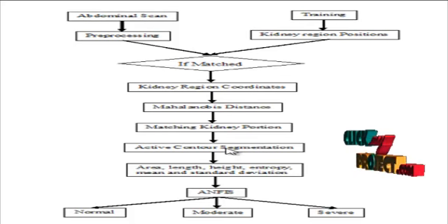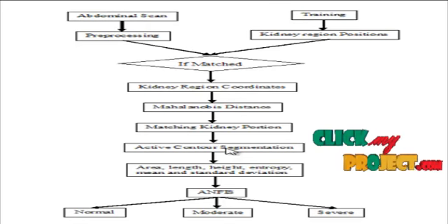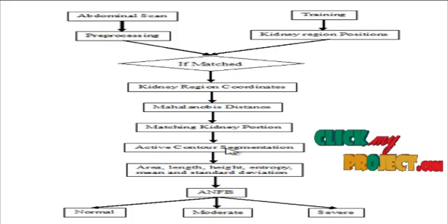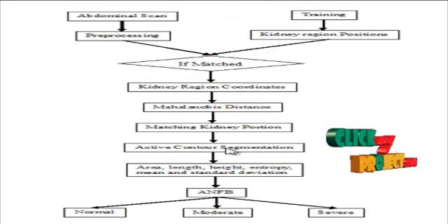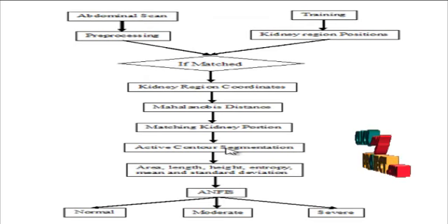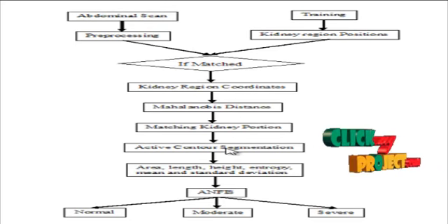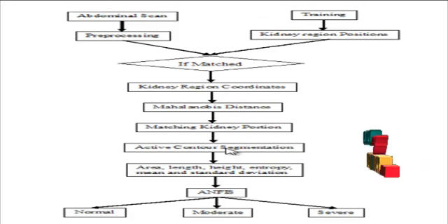After the matching of them, the active contour segmentation is employed. The active contour segmentation grows the regions based on the intensity ranges and stops when the overall intensity is similar. So for the active contour, the input shapes will be the registered shapes given in the process.